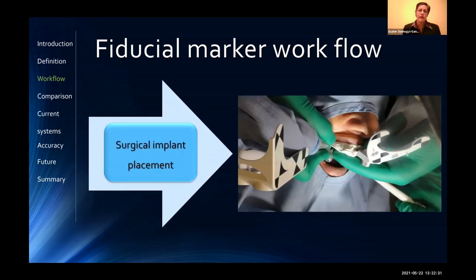So if somebody has a CBCT in their office and they have this virtual navigation system or dynamic navigation system, it can literally be an hour before we can implement a virtual guide and start drilling an implant in the patient's mouth. So it is very nice and flexible.